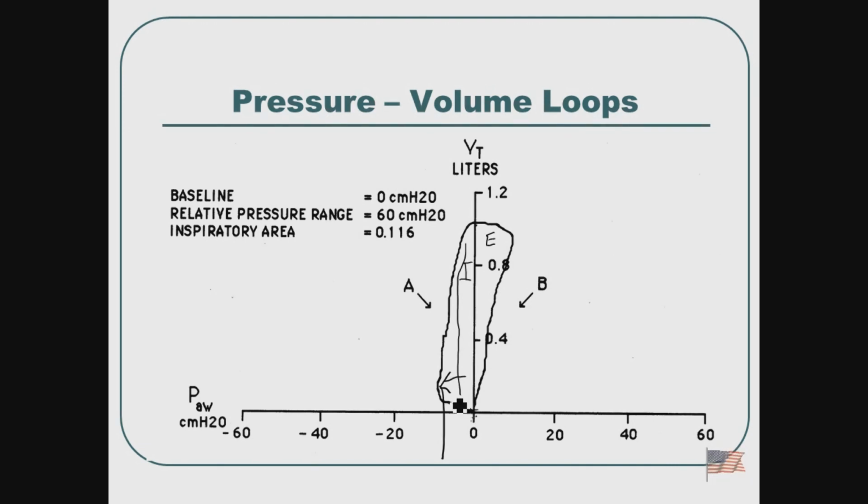Compliance or resistance? That's how you kind of... I don't know. And in reality, we really don't always exhale exactly what we take in. There's going to be a little bit of variance on a breath basis. Yeah. I'm not a graph expert, so... Yeah, you are. You're going to be after today. You're going to be a graph expert.